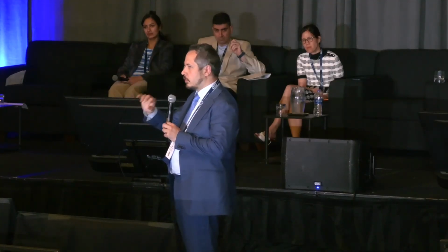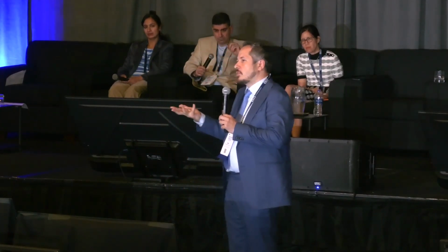The other way I would have approached this is wire, McNamara or ECOS, and get out. No pictures, no crossing, no seeing distal, because I have the distal flow from the profunda. Then come back 12, 18 hours later, and you can figure out what's going on. More likely than not, you have all that dissolved, and either you put a Viabahn stent, or the stent fails from a distal edge dissection.